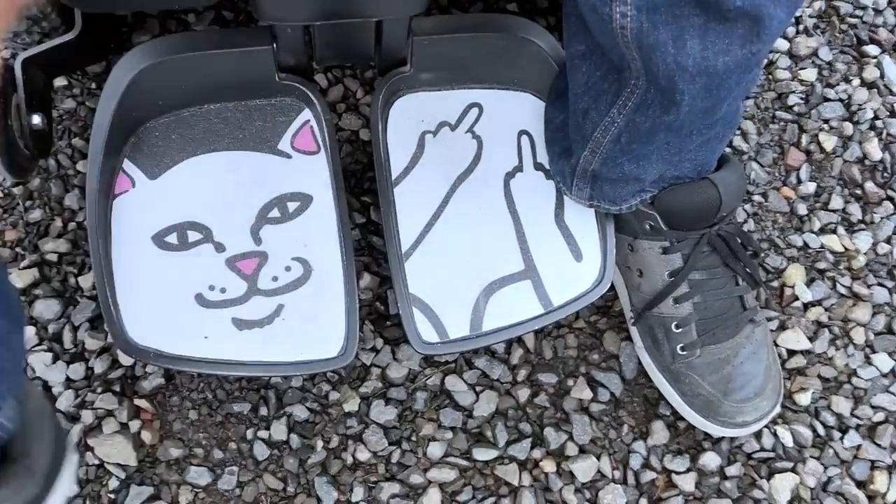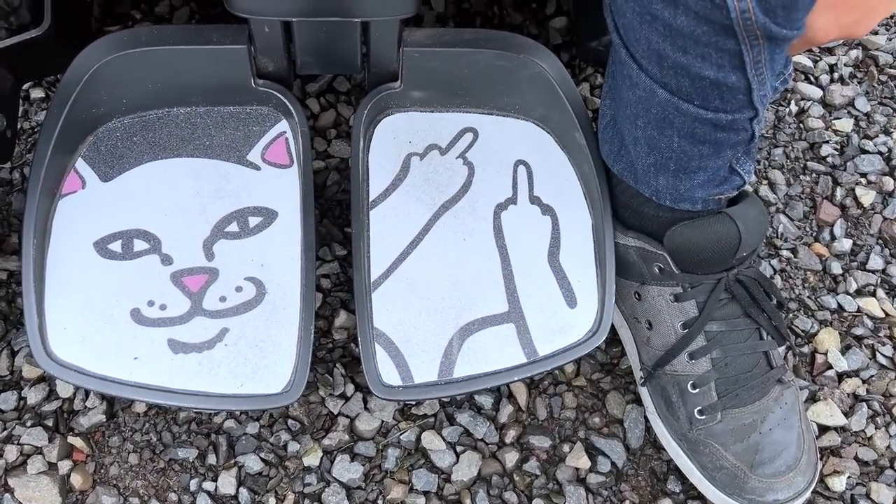And there we go. Some of the OCD has been mitigated. The rattling is gone and we have cool offensive grip tape. My backrest is now very solid and there's no squeaking from those bolts. There is a little bit of movement on the direct backrest adapter, but it feels a lot more solid now. And I know those bolts are not digging into the metal like they should not be.